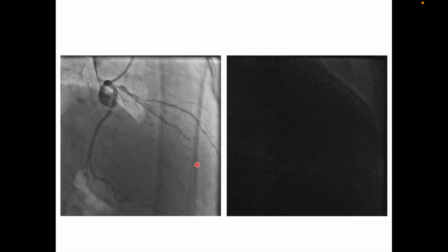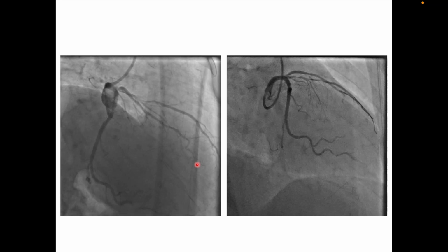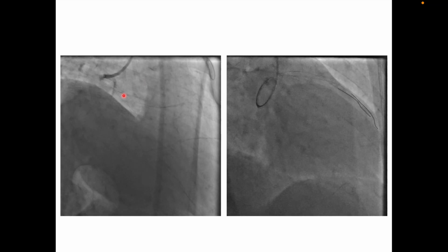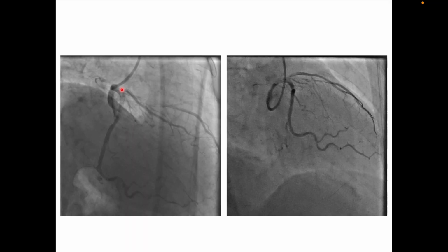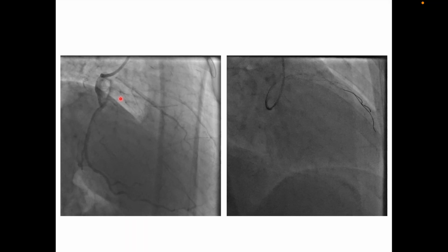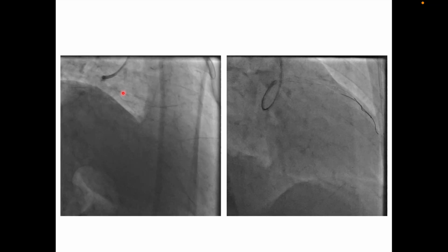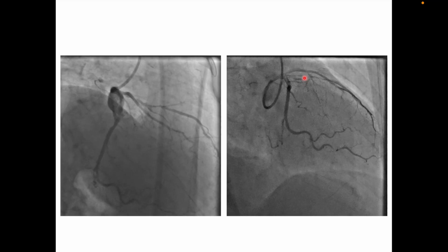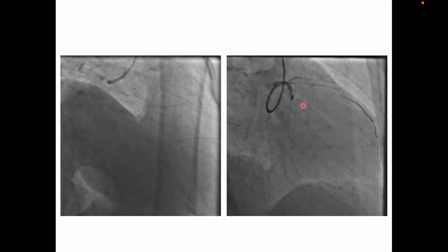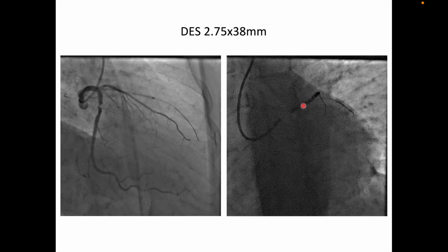So finally we found this image, a very modified angiographic view, where I can see some foothold in the ostium of the LAD, because on the IVUS run I had seen that there is an ostial foothold which I can utilize. So in this image I finally decided to wire and put my stent. That's what we did. We wired the diagonal. We brought in the LAD stent.